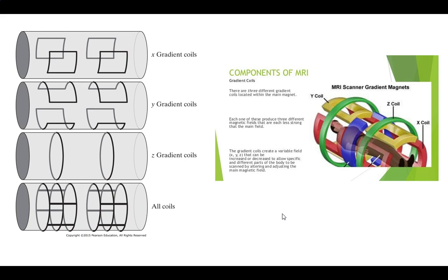So the Z ones, let me start actually on here. You can see the Z coils, those 2 locations. It's kind of nicely shown out here on the green. This one is pretty much useless by my mind. But you can see the Z coils, which is going to set up basically this ramp function down your body. And that's these gradient coils, the whole purpose.